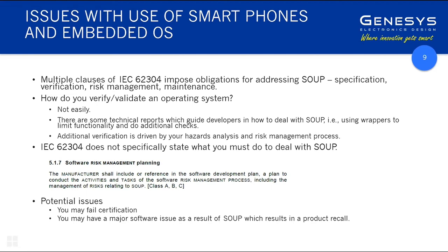So if I've got a device being run in the theater, and nothing being run on that device includes any SOUP or any use of these higher level displays, but then after the surgery I decide to plug my device into another device that gives me visual feedback of some additional information that is otherwise stored on the device anyway, well, that's actually okay.